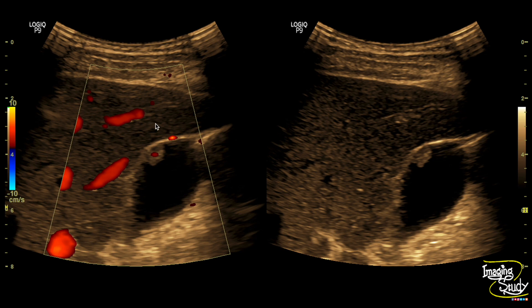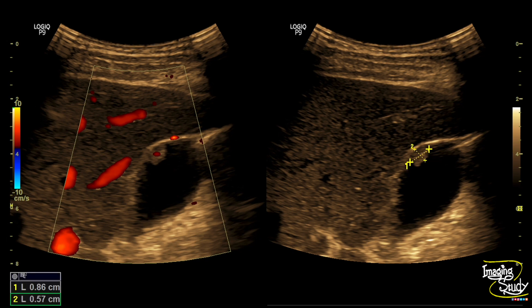Here you can see this irregular polypoid lesion has a heterogeneous echotexture and a broad base, which goes in favor of neoplasm. On the left image, the color Doppler shows a prominent blood vessel supplying the lesion. We have measured the size and it was around 8 by 5 millimeters.